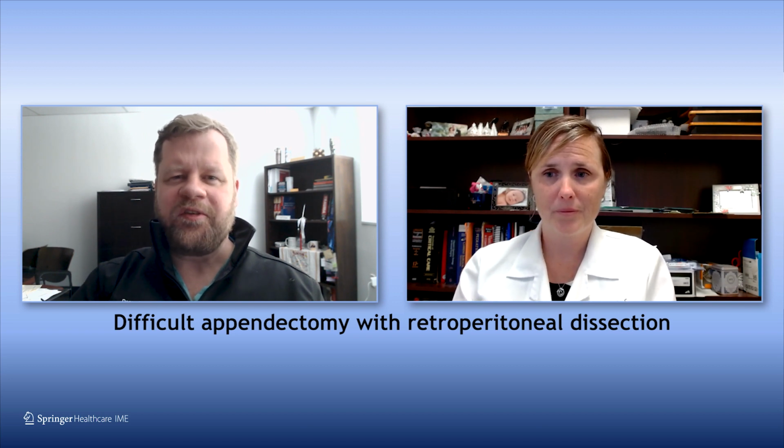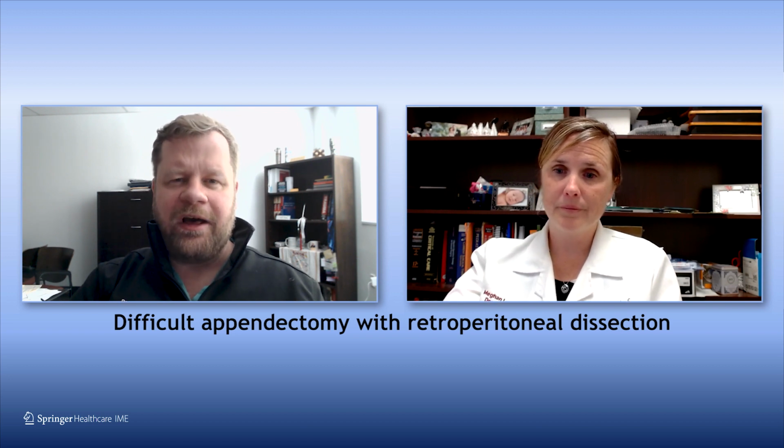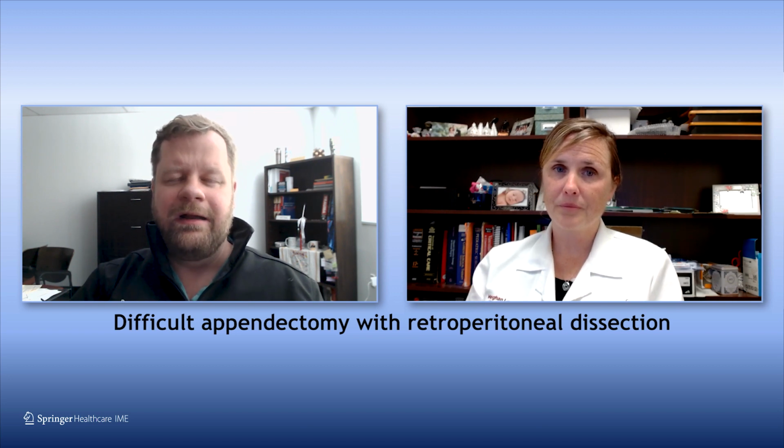And I think your first comment of thinking about it similarly to the gallbladder. One of the main points is that a lot of these agents can be similarly applied in different situations, but it's knowing from experience and in talking with others how to read and interpret the bleeding situation before you, in combination with the patient and clinical factors that you have worked up preoperatively to the best of your ability, including their coagulation and bleeding status, and knowing how much to use and where and when, and being precise and diligent with it. But knowing that this type of diffuse ooze can really happen anywhere, it's easy to apply these things to different situations, while still keeping in mind that every situation is different, as every surgeon well knows. For sure, definitely.